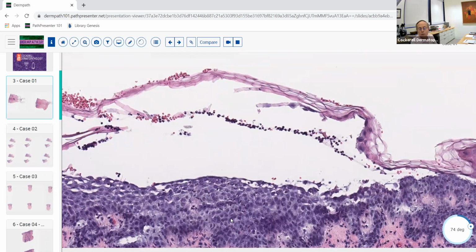So the differential diagnosis of that pattern obviously is going to be superficial pemphigus, right? That can give you a subcorneal blister with acantholysis. And it makes a lot of sense that it would, because the way that you get the blister in this condition, bullous impetigo, or in staph scalded skin syndrome, is that the bacterium produces an epidermolytic toxin that causes lysis of the desmosomes, very similar to the way the antibodies in superficial pemphigus lead to lysis of the desmoglein around the keratinocytes. So it would make sense that they would look the same.